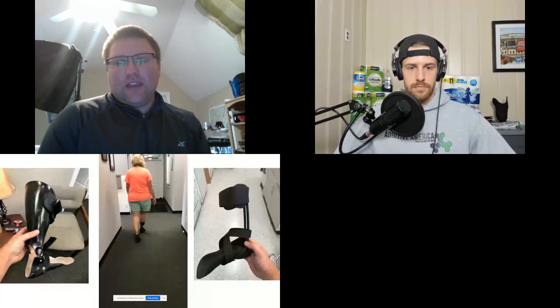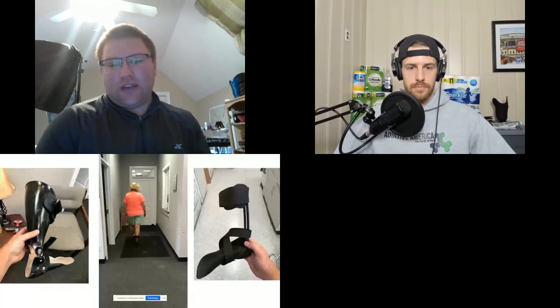So if you can't hear the audio, she is saying it feels so light, it moves with my body. Every time I step, I feel like, and it's just pulling her toes up. Now the interesting thing about Penny is when she came to me for the AFO, she's like, here's the deal. I want to have a brace that I don't need to wear a sock with, and I'm going to wear Kiva style sandals. And that is an orthotist nightmare, is hearing, hey, I'm not going to wear socks and I'm not going to wear shoes. Tennis shoes are what you need to do. And I said, well, hey, let's give it a shot. Let's try to multi-jet fusion something.